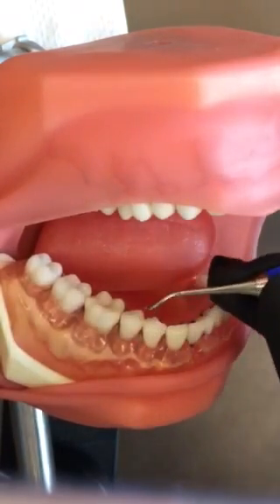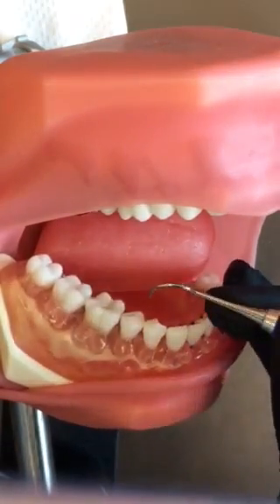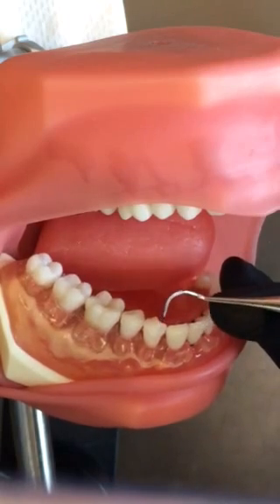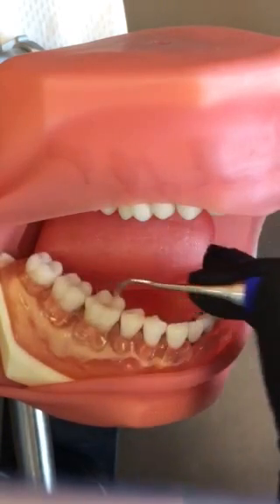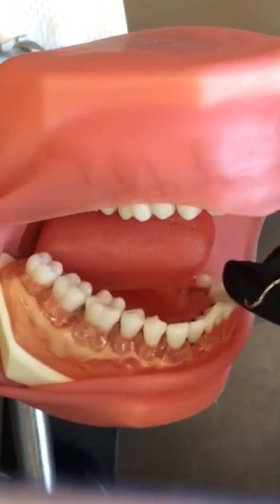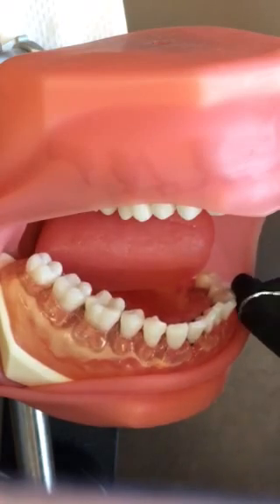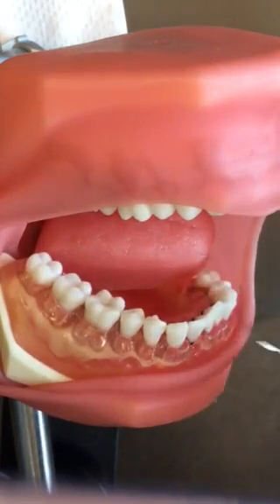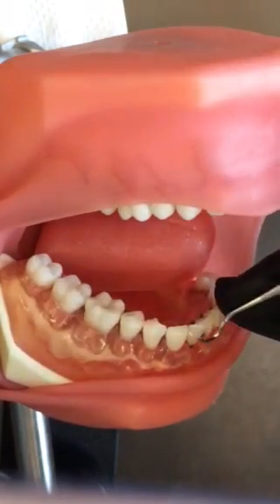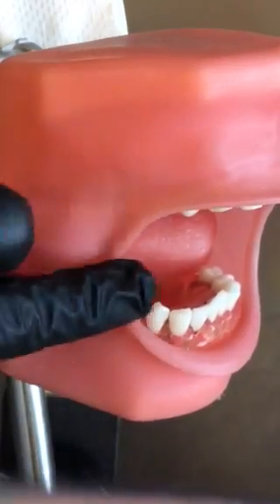Though this instrument is meant for posterior teeth, you will find once you become a little more advanced that it also works well on the anteriors. Just remember the rule — like you have with the 1112 Explorer — that what works in the lower right, canine to canine, will wrap around and work on the surfaces away from you. Once you complete the surface away from you on the left canine, you can flip your instrument. This end will work on the lower left and then on the surfaces toward you. But for now, we're going to stay using this posterior only.